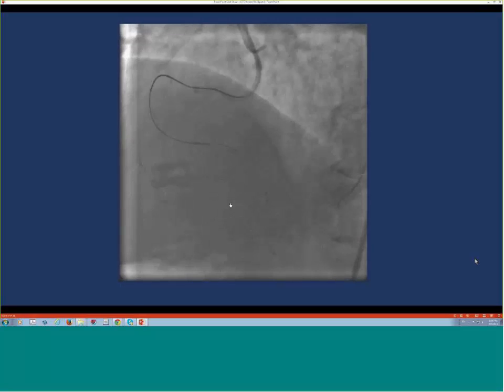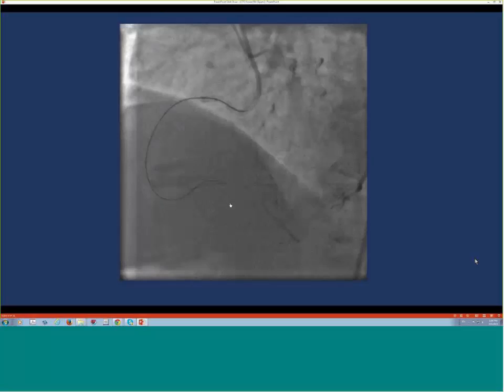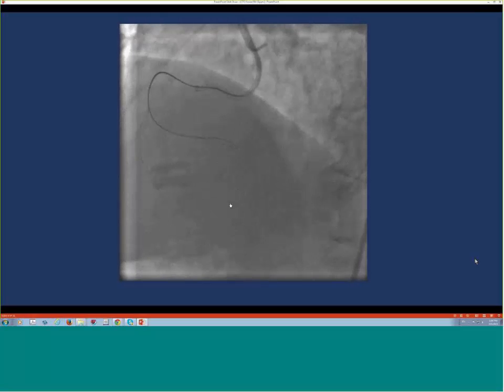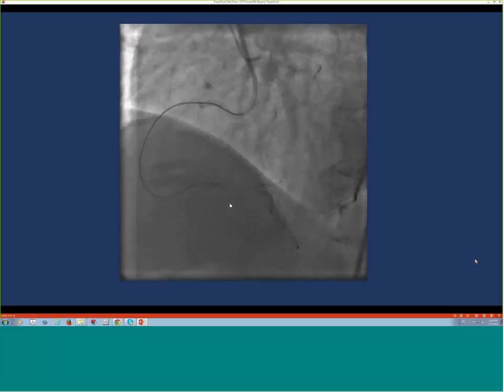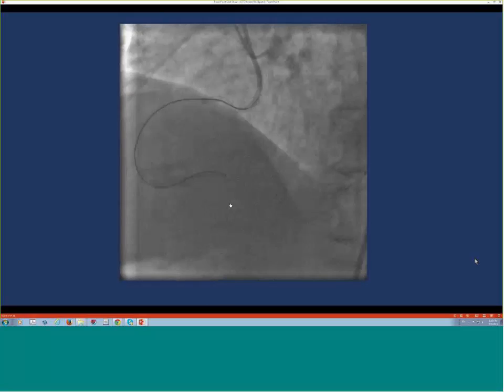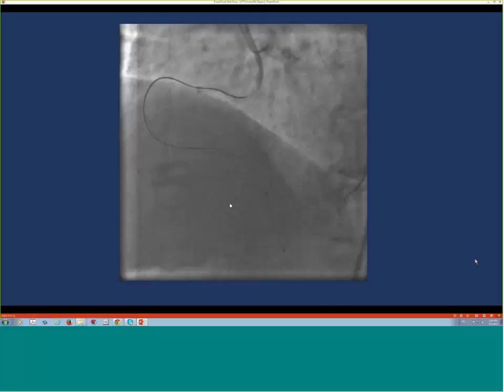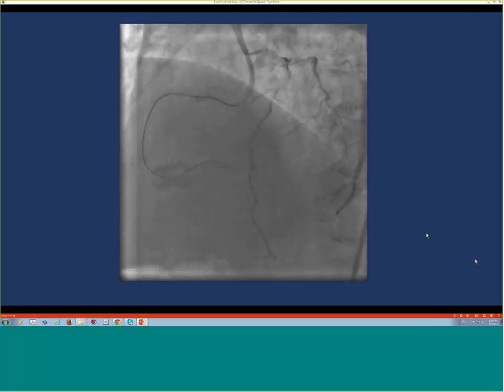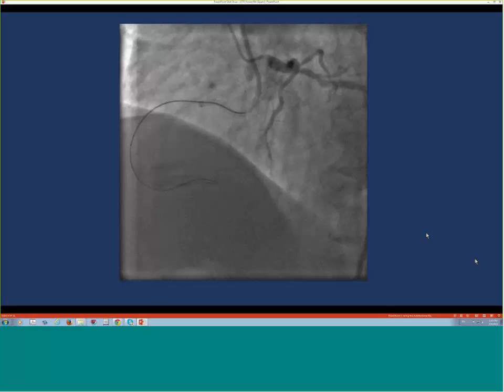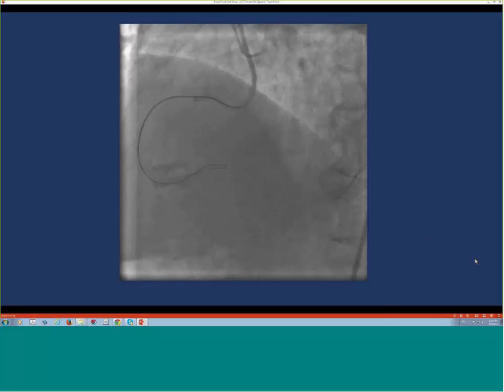Yeah. So here's our knuckled wire in the distal right, and I think in retrospect that the loop was a little on the far side, but we thought we would spin the CrossBoss down and then do Stingray dissection reentry. The problem was we couldn't get the CrossBoss past the point where you see it there. Okay, there's some calcium over there, so maybe you just couldn't track through the calcium. That was the problem. So the issue was this is where the difficult passage was, and so we thought that the next step would be to use a small balloon to try to make a little bit more space there.